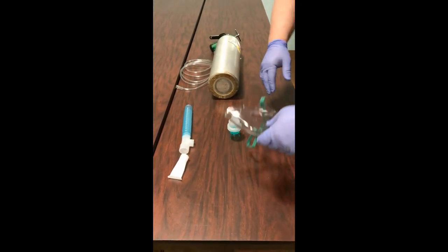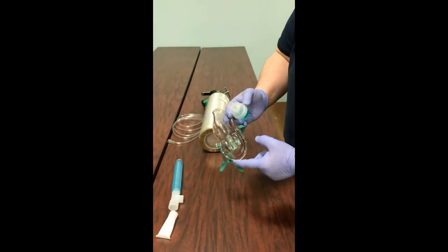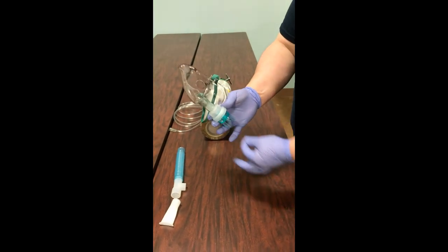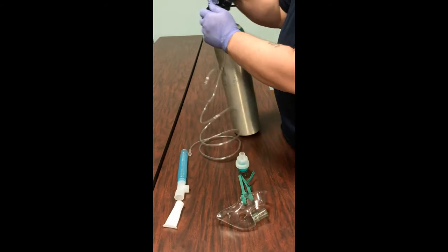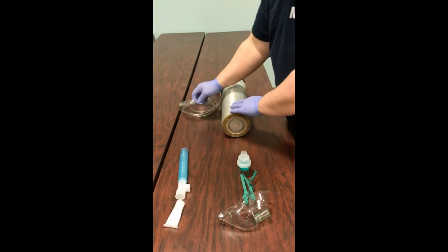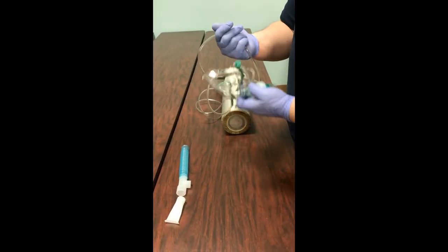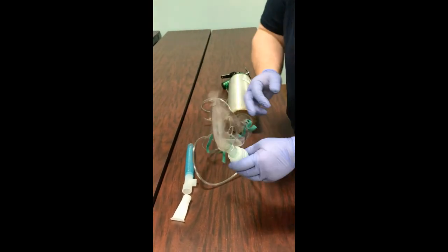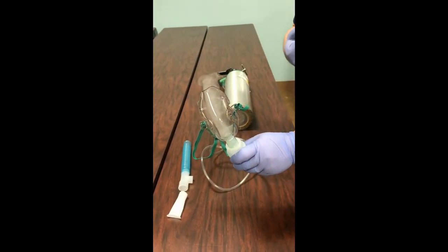The other way to deliver the nebulizer is with a simple mask — one that doesn't have a reservoir bag. The chamber goes in and the O2 tubing attaches here. We set up the tank, set it to our preferred flow rate, and assemble it. Now we can see it's aerosolizing and the patient is able to breathe the medication in.